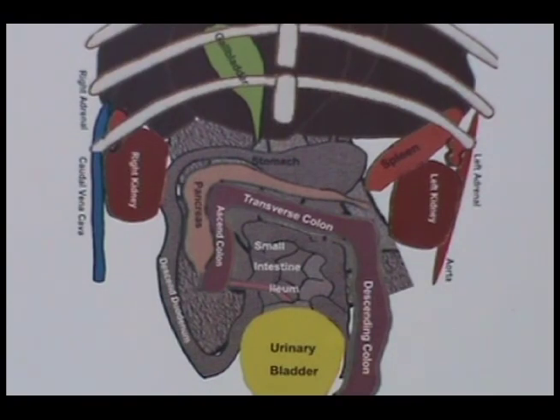There are a few differences between canine and feline anatomy. On the feline abdominal graphic, you see that the stomach does not extend as far to the patient's right as in the dog. The normal, empty feline stomach usually ends near the ventral midline. The transverse duodenum is relatively longer than in the dog.